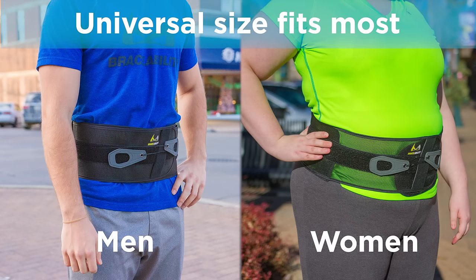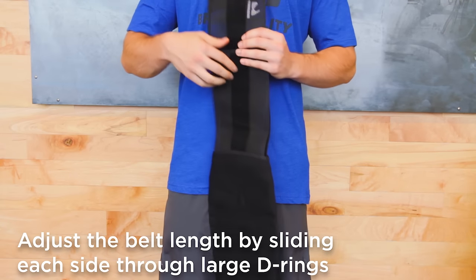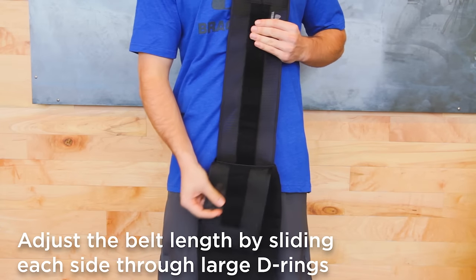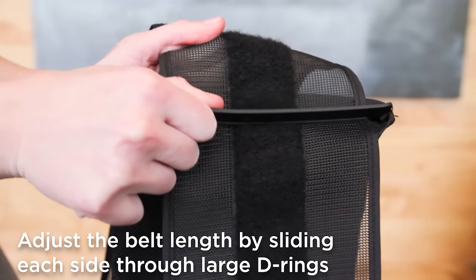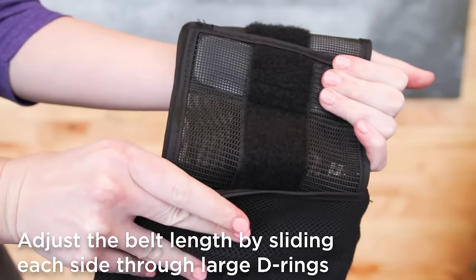Thanks to its one size fits most design, you can easily adjust the length of the belt. Just slide the belt through the large D-ring until your desired length is achieved. Make sure to adjust the right and left sides equally for optimal support.